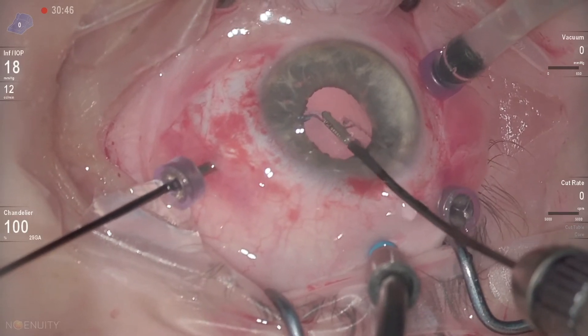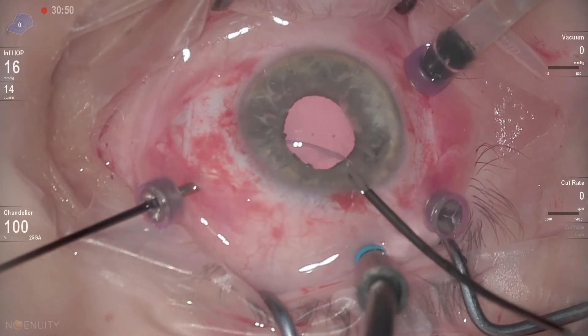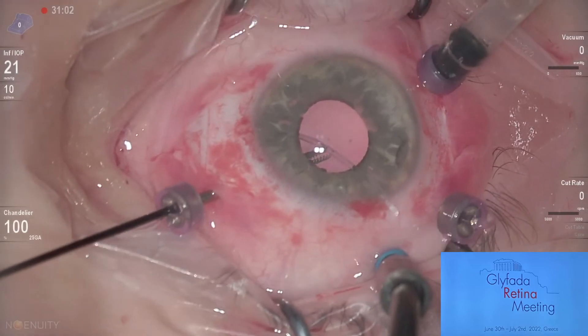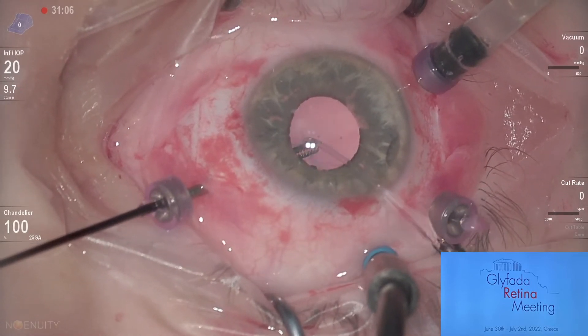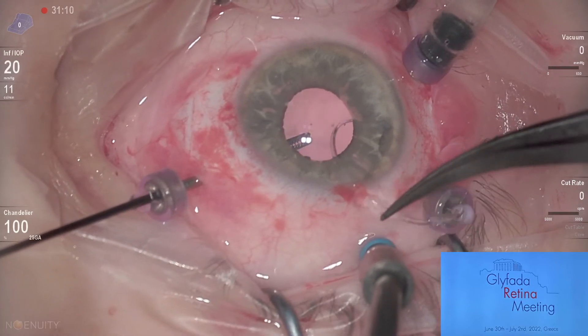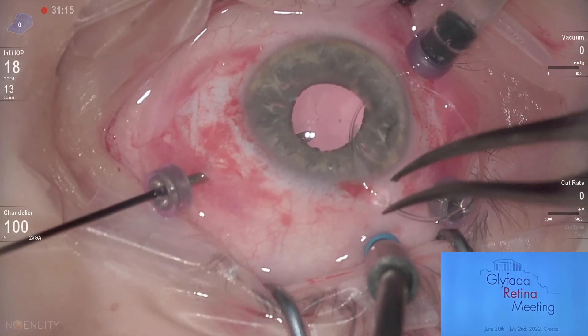I am using micro forceps for that. With a gentle rotation I believe I will be able to extract it without causing any peripheral damage, because the CTR ring is really tricky to remove.